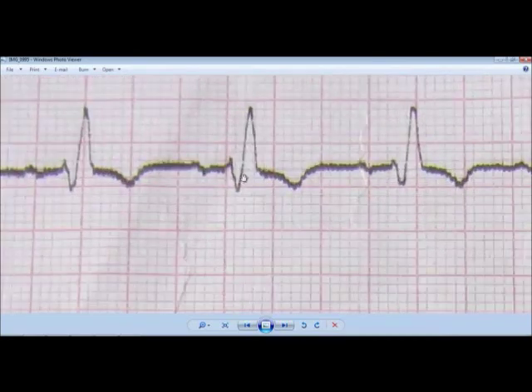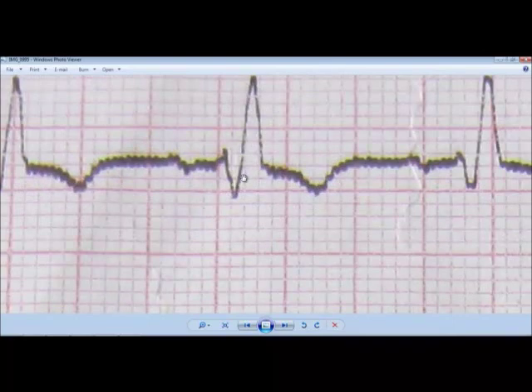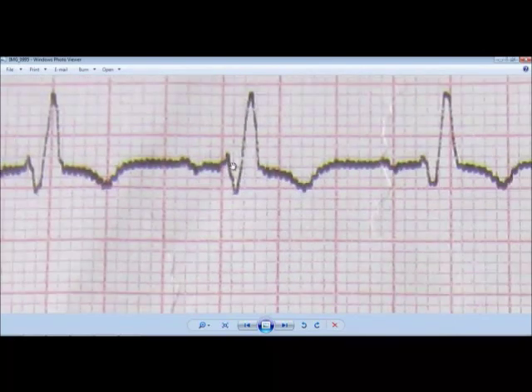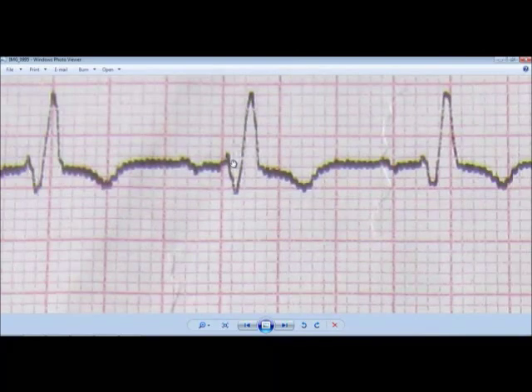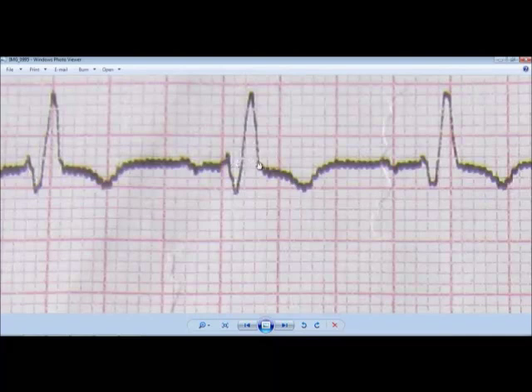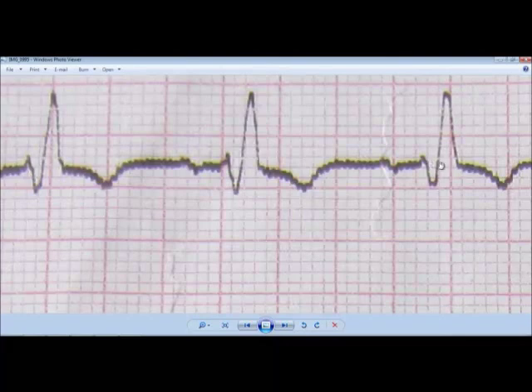You can also see, if you enlarge it, the QRS duration is increased. The QRS complex duration is 1, 2, 3 — a little bit more than 3, around 3 and a half small squares. It is more than 120 ms. So a wide QRS is also present here.